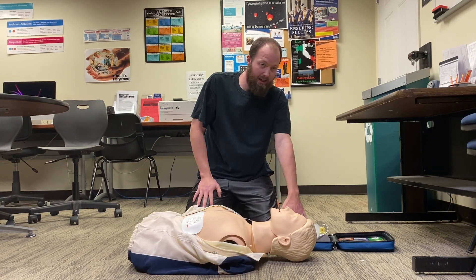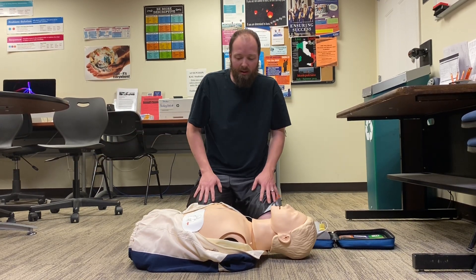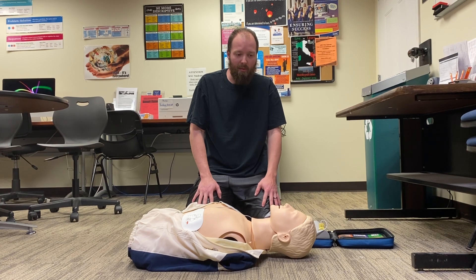Once this is applied, the AED will analyze, so you want to make sure you clear that person away. Make sure no one's touching them so they don't get harmed, and that the AED can pick up the appropriate signal.